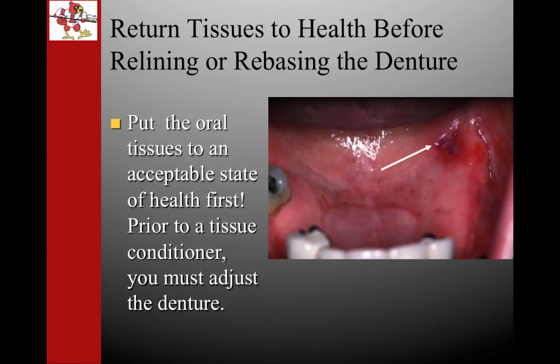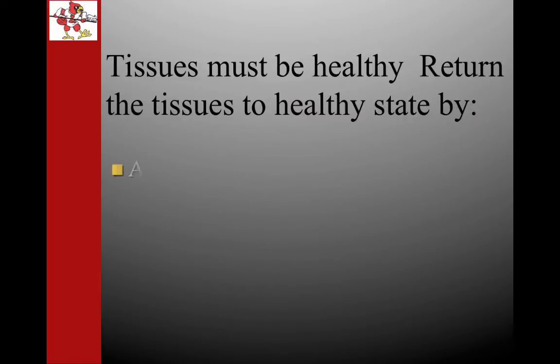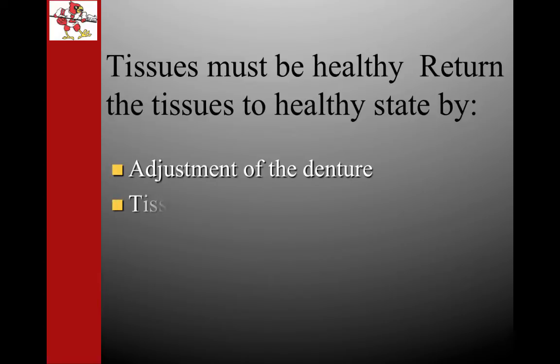Before you rebase or reline any denture, partial or complete, it's absolutely necessary for you to get the tissues back to a state of health. Adjust the denture in any area where a lesion is present and allow it to heal before taking an impression for the reline or the rebase. Sometimes tissue conditioning may be necessary if the denture base is ill-fitting. Before any tissue conditioning material is added, though, any pressure spot must be relieved or you will not achieve your goal of a lesion-free area.